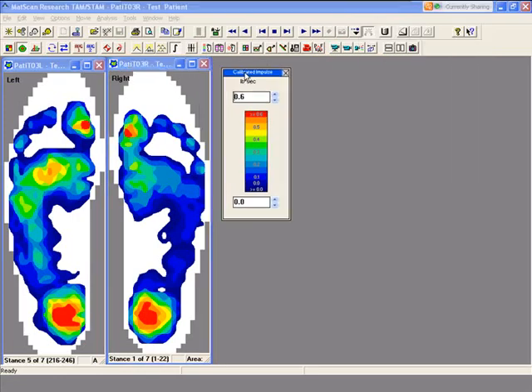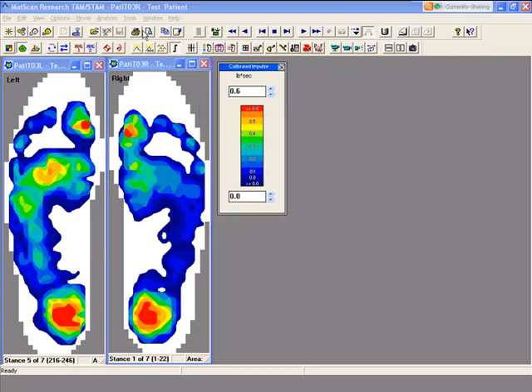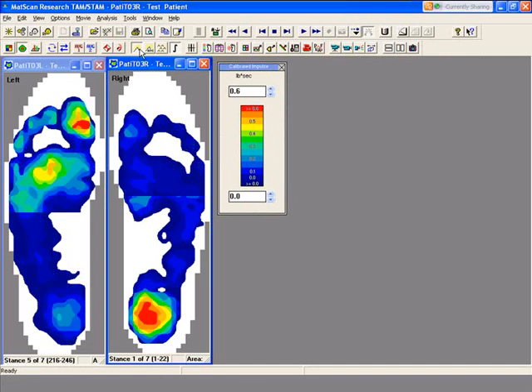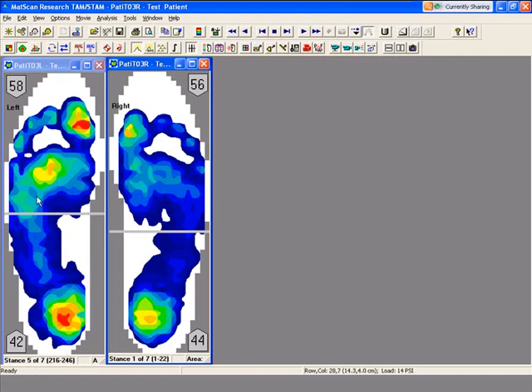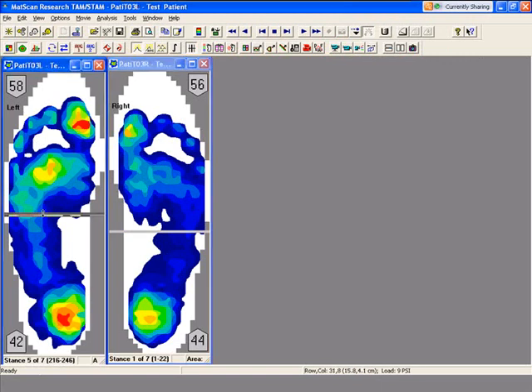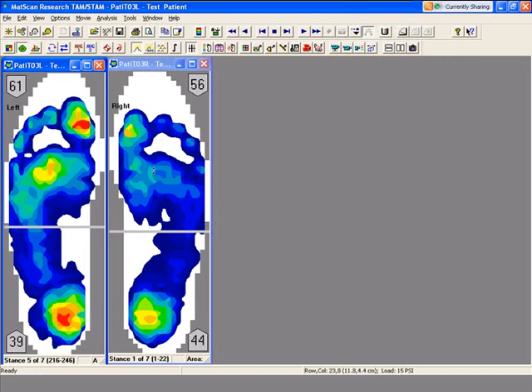Now we're going to look at the percentage of force. I'm going to click on the percentage icon. What you can see is how much force distribution with the foot in the rear foot and the forefoot. You can see about 60-40 on the left foot and about 55-45 on the right foot.